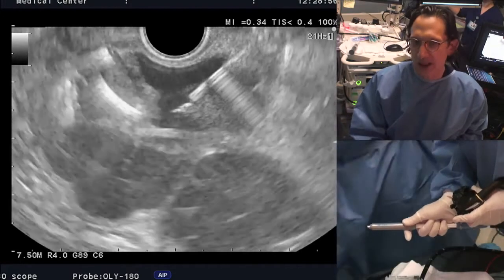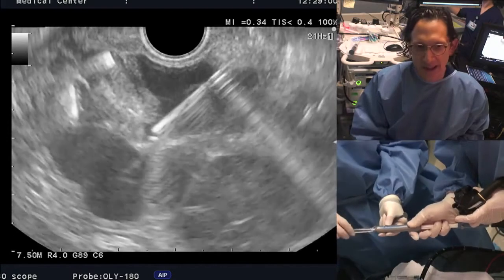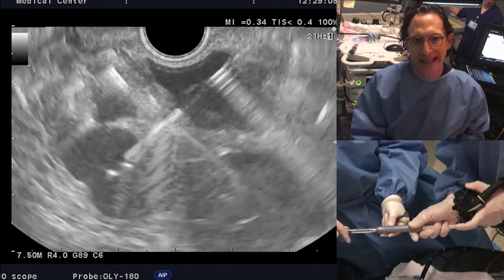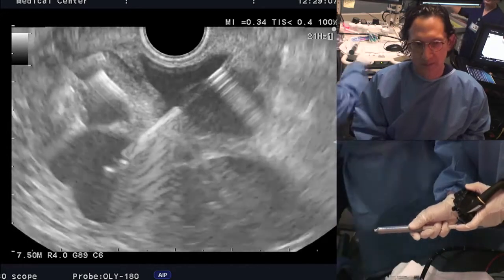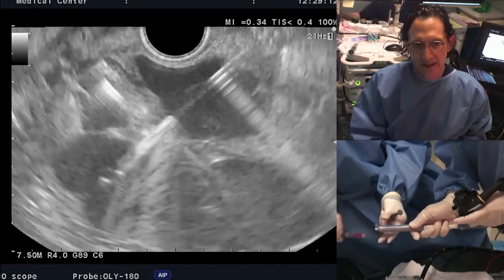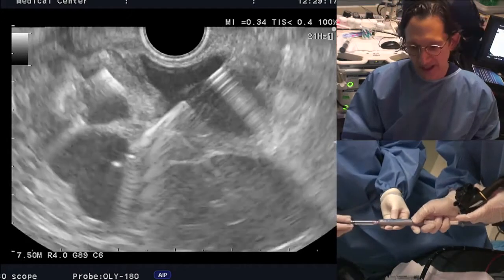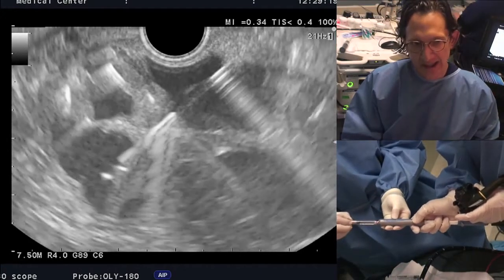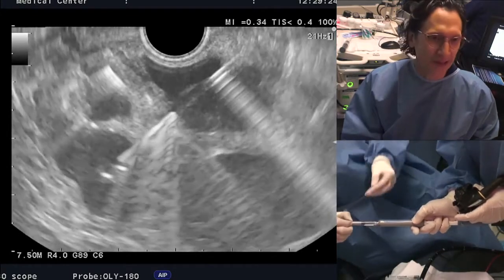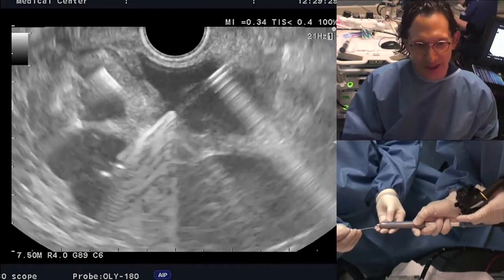We're going to first flush the needle very carefully. And while she's getting ready, I'm going to go down here to a deeper level. See there. All right, now I'm going to put another coil down here. Okay, so same protocol here, same steps. We flushed it, right? Now it's coming, flushing. You see the air bubbles coming, not air bubbles, but the water. It's actually a little bit of air in the H2O. There is an O in the H2O, so that's what you're seeing.